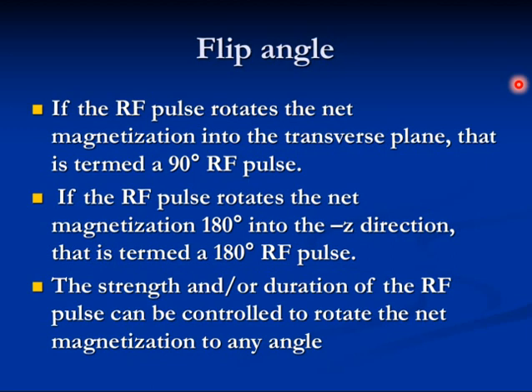Put it at a 30 degree angle, 40, 90, 180, as you like. If you turn it by 90, this is a 90 degree pulse. If you turn it by 180, it's a 180 degree pulse. As you like. Protons are very nice things that you can control, and they obey.